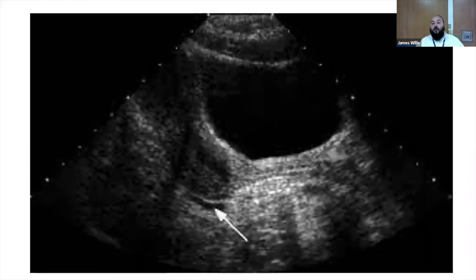The studies show that the greatest volume is detected during ovulation, and the prevalence of transient physiologic free fluid in young women is actually 36 to 40%. So with a patient who is a multi-trauma patient, and you see this image, are you going to interpret this as physiologic free fluid, or is this a positive FAST? What are you going to do next? Similar to children, young women and pregnant women, you want to reduce the amount of CT abdomen pelvis that you're obtaining to reduce the amount of radiation, if at all possible. That's the whole reason to discuss this topic.